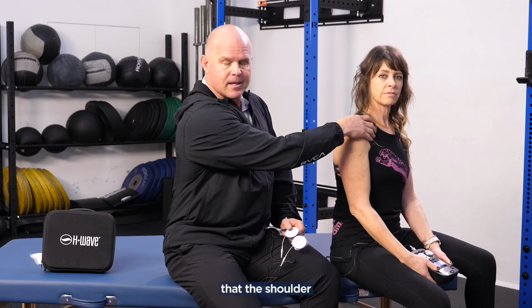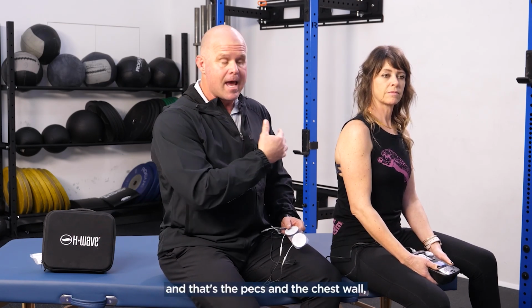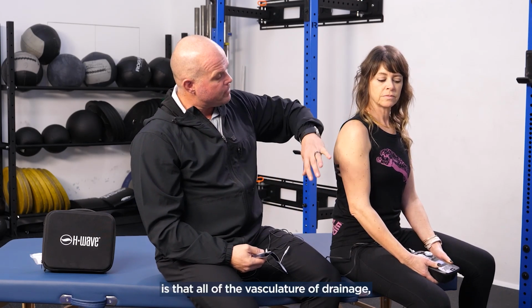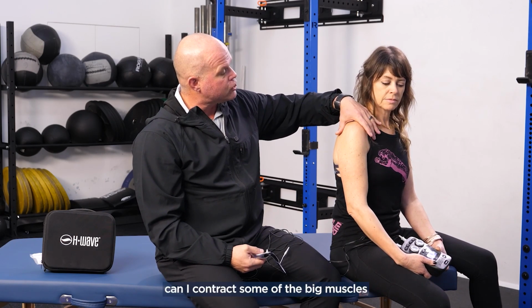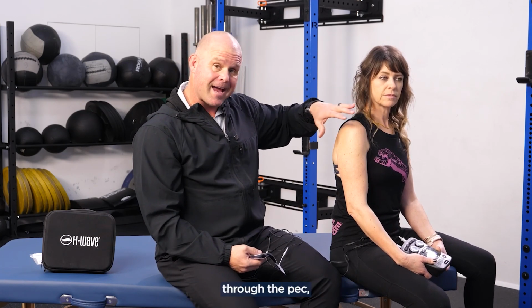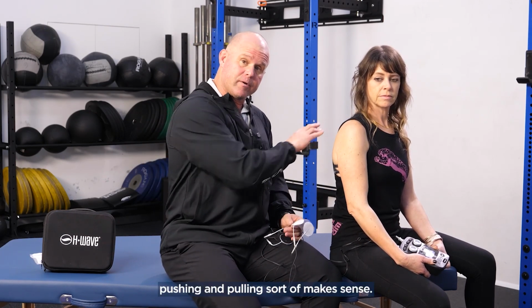But also let's appreciate that the shoulder is attached to one of the big drivers of power in the front of the body, and that's the pecs and the chest wall. Interestingly, all of the vasculature of drainage, the lymphatic system, is ultimately going to drain out through the neck. So if we can contract some of the big muscles around the traps, around the neck, through the pec, we can be bigger drivers of decongestion. Of course, pushing and pulling makes sense.